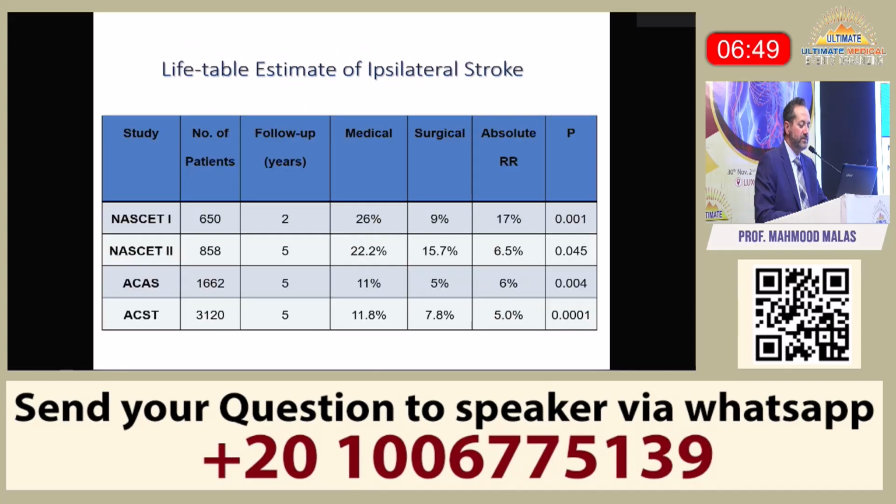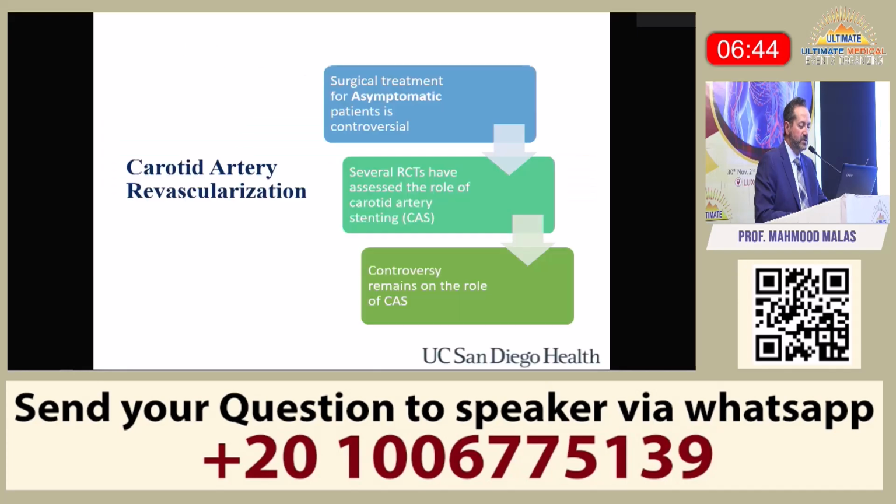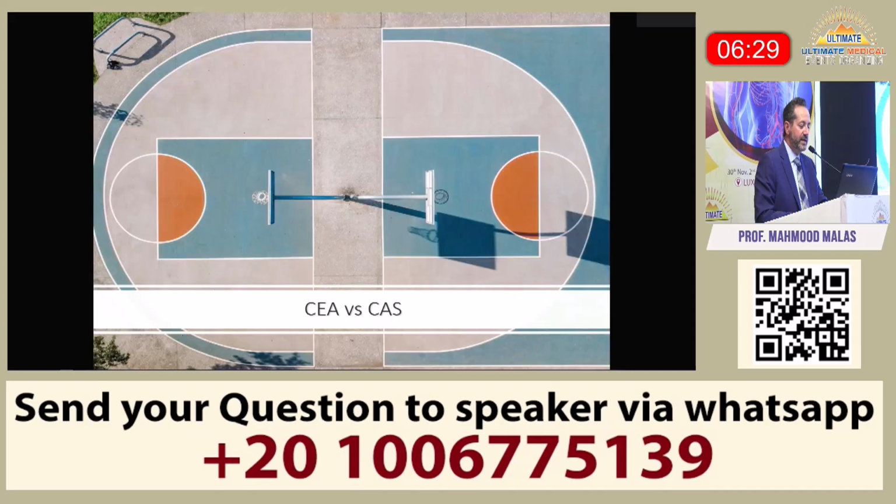And these are the 4 randomized trials that Dr. AbuRahma talked to you about, but essentially very beneficial. But we still today don't really know what to do with stenting. It's still debatable, the role of stenting. And there's also a huge question about asymptomatic patients. Should they be getting only medical management? This is being debated again.